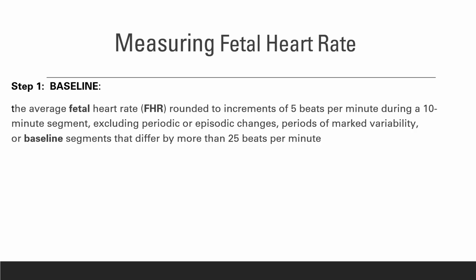Once you've established your baseline, your variability, and whether there's acceleration, the last step is to determine if there's any deceleration. A deceleration is a decrease from the baseline, indicating a complication ranging from normal to bad regarding fetal well-being. We will go deep into the deceleration segment in a little bit. There are good decelerations, and then there are also bad decelerations, depending on the situation.